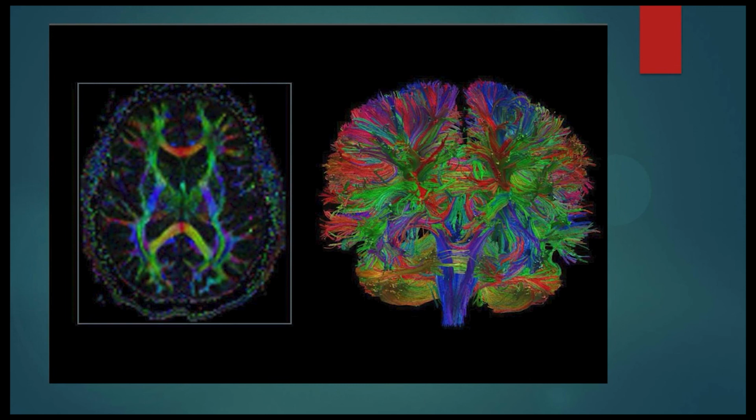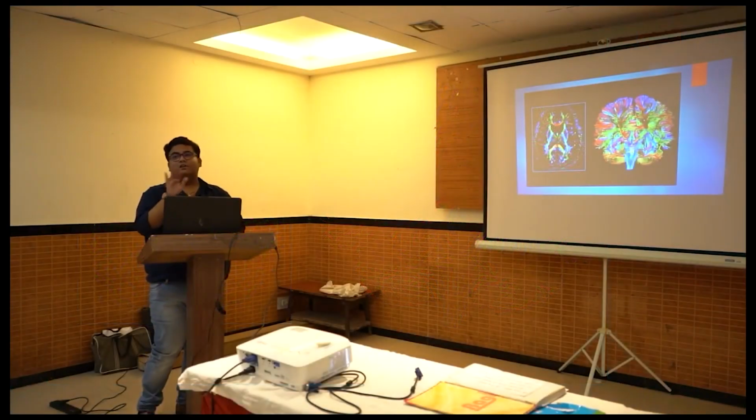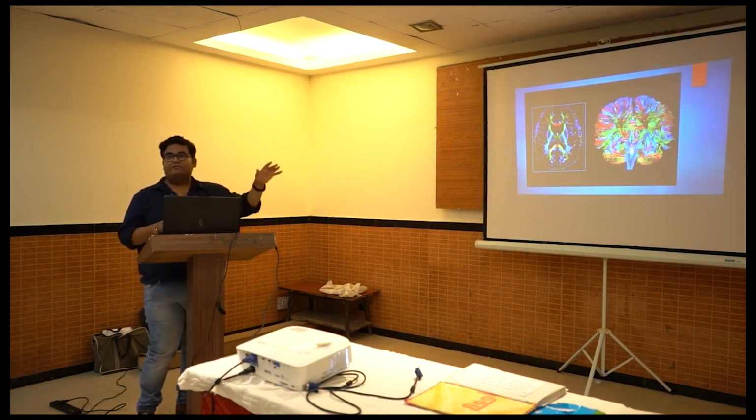How are we going to use this? If there is a tumor lying somewhere very near to the tract, or if it's engulfing the tract, we will not dissect the tumor. We will refrain from that because the patient will develop a deficit after removing that tumor.